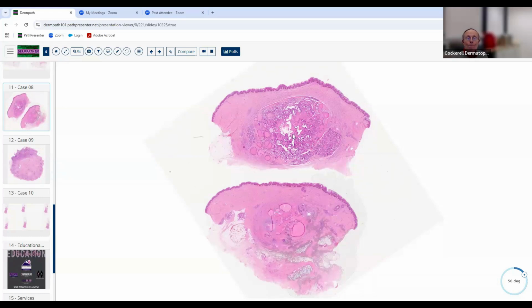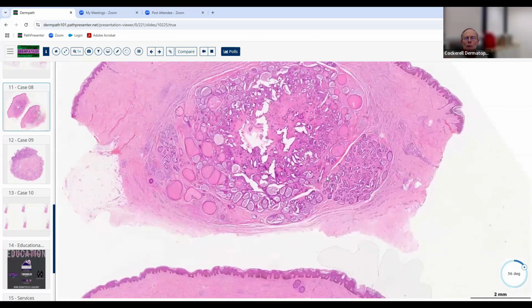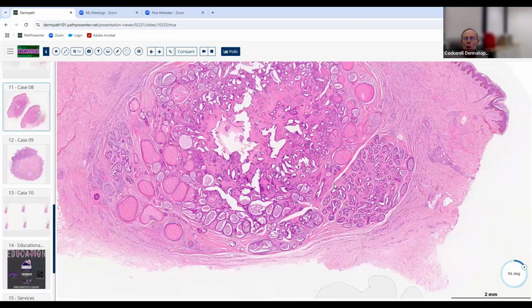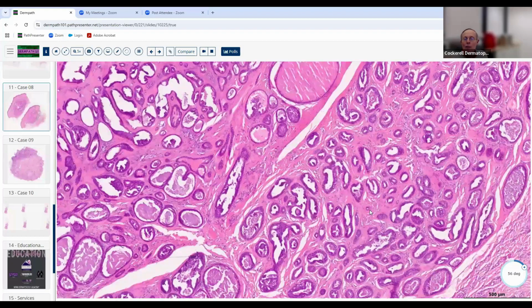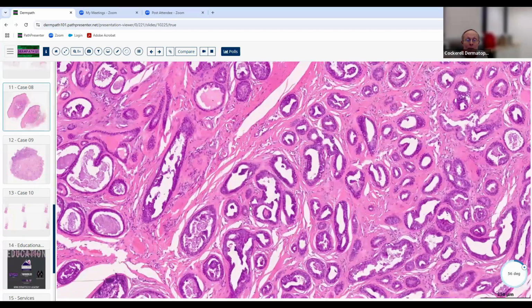It looks benign. So we're going to do the same thing we did when we looked at the Syringocystadenoma Papilliferum and the Trichoepithelioma. We looked at all these various neoplasms today. We're going to see what kind of differentiation it's exhibiting. So small, symmetrical, circumscribed, benign, epithelial. What kind of epithelium? And we've already seen this epithelium twice today. So you're getting a theme.